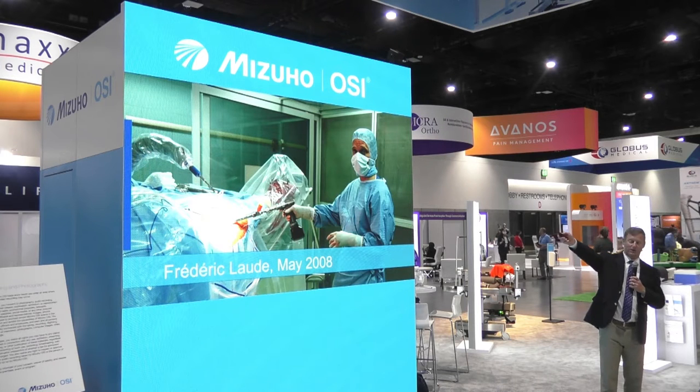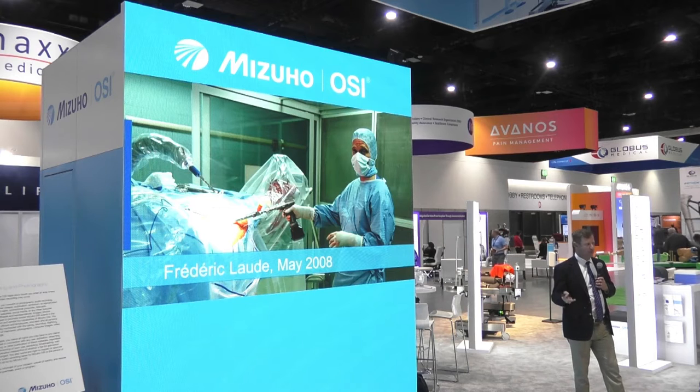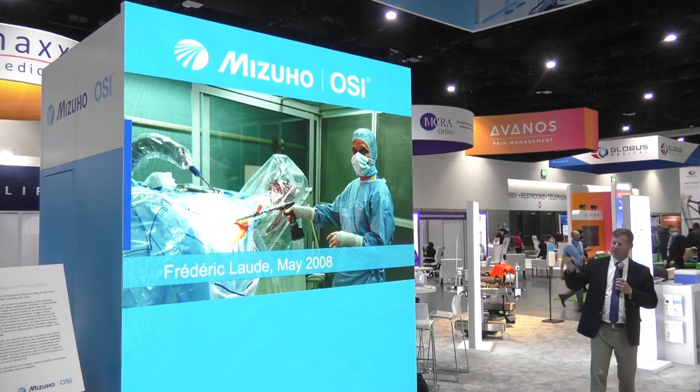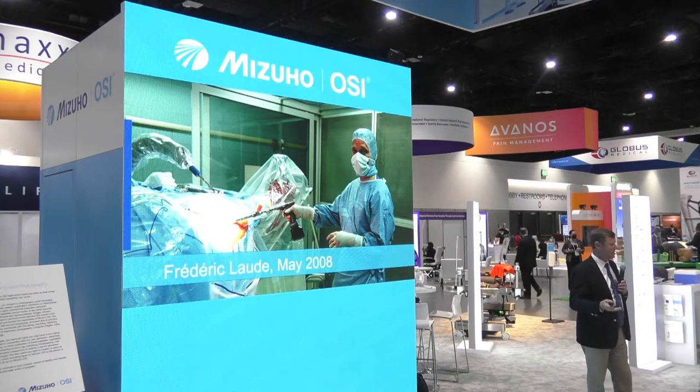He has this mechanical arm that serves as a self-retaining retractor, and with the self-retaining retractor coupled with, in this case, an orthopedic table, he was able to get through that. So I said, well, I've already got this orthopedic table. I've got something that can do all of that.